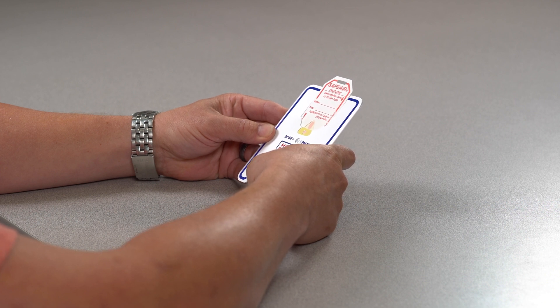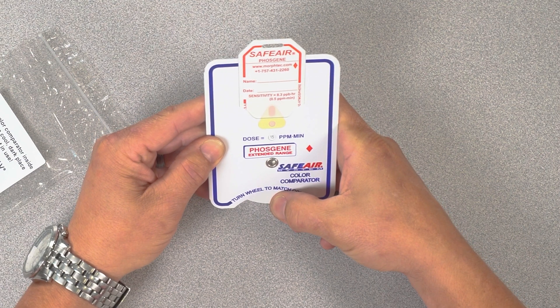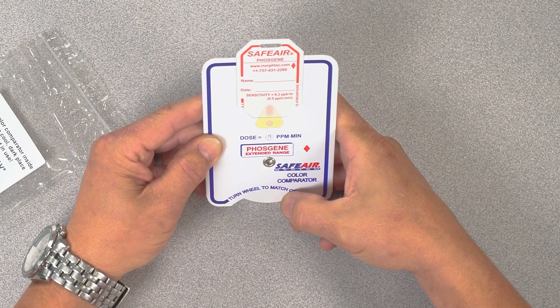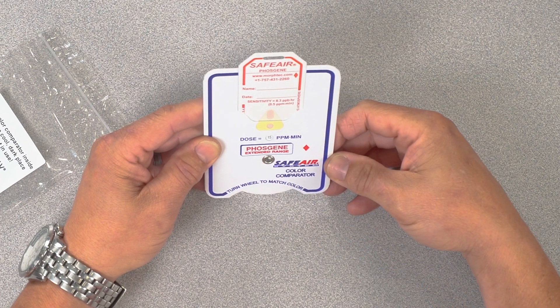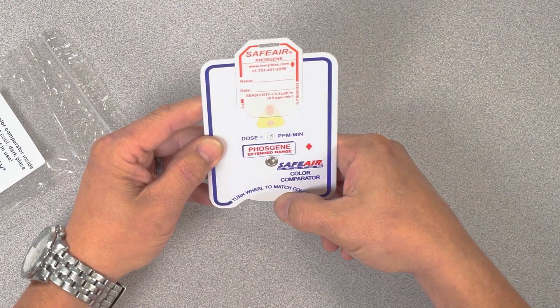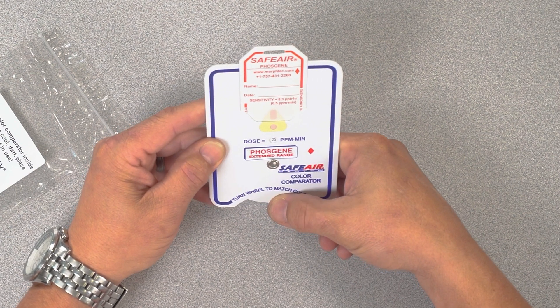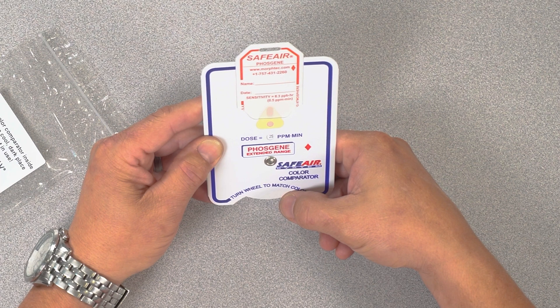Operation of the color comparator is straightforward. Once the badge is slid into the color comparator, simply turn the comparator wheel until the color of the exposed badge matches the color in the comparator. To ensure proper exposure dose readout, spin the wheel one shade darker than the shade of the exposed badge.